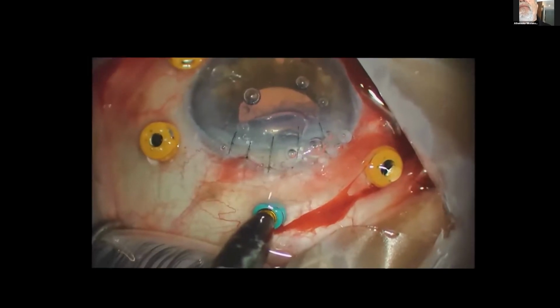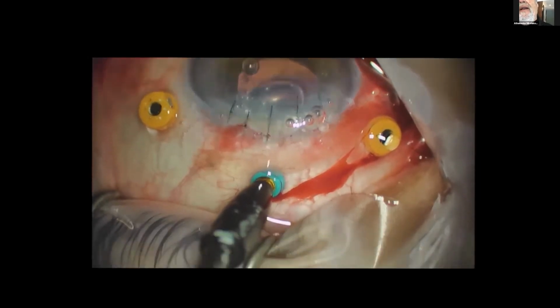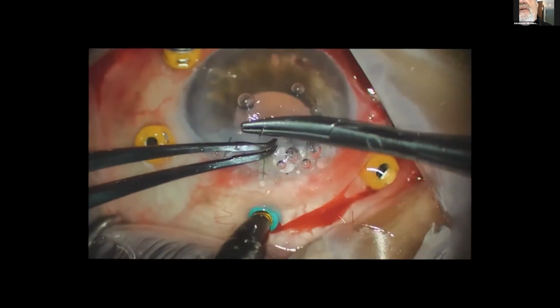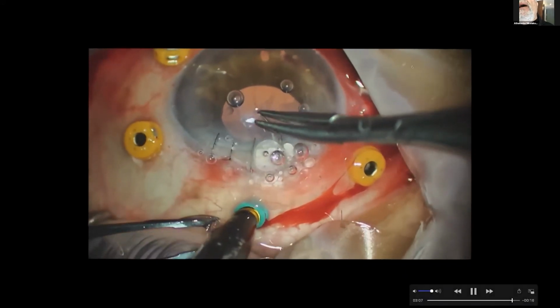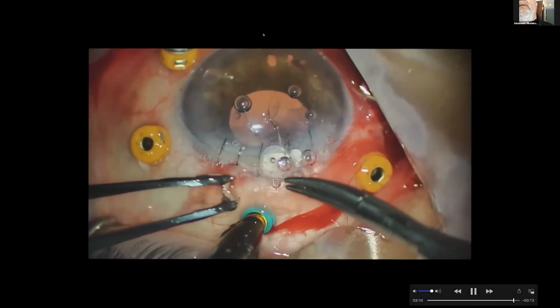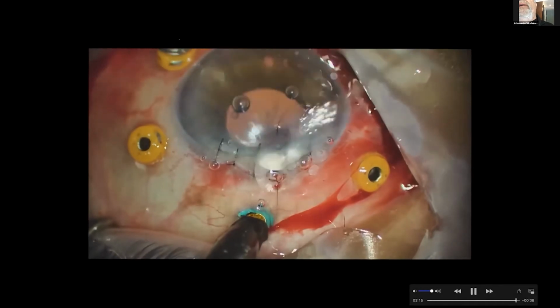Then I used to do this injection of gas and try to flatten the retina. Because it's a huge tear, almost a quarter of the eye, about 6 to 9, I was ready to put some gas in it. Then I saw that it also has a Descemet detachment. If you leave the Descemet detachment, so I use the steamroller technique. I put a gas bubble, an air bubble, and I push the Descemet back, and then I cut a suture through and through in order to save the cornea from haziness.